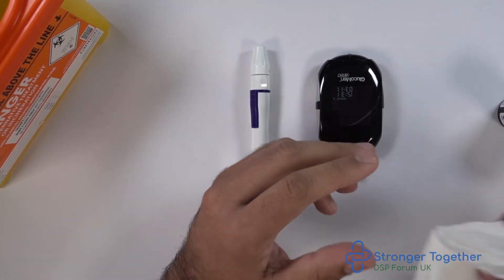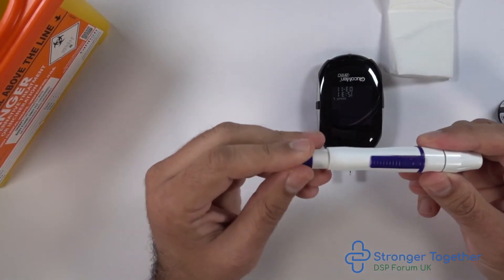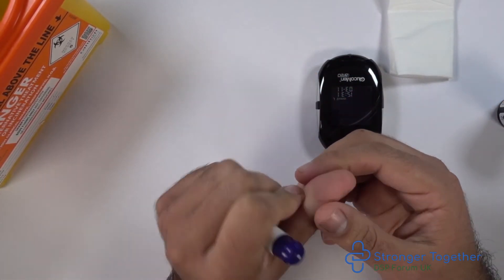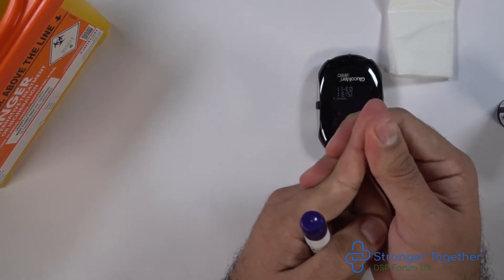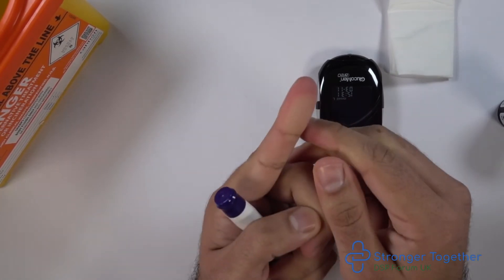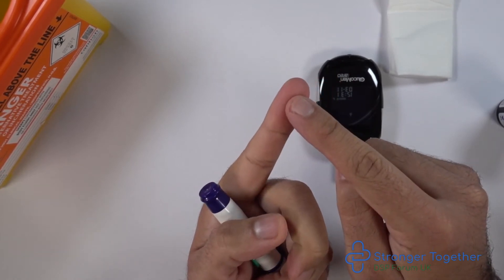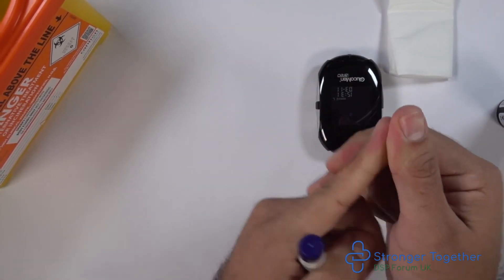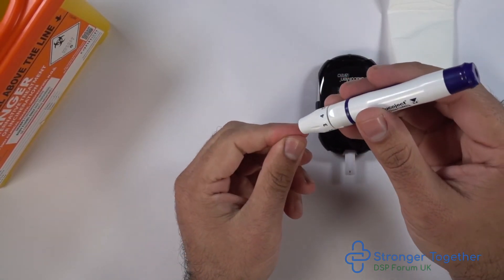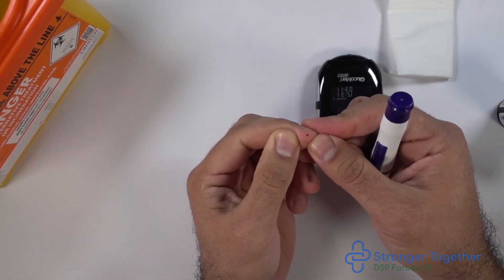Here we have a tissue ready. When getting ready to lance our finger, make sure you have loaded your device beforehand. Remember we will have washed our hands prior to testing. We can choose any of our fingers for the procedure. Remember to rub your fingers as shown here. Remember to lance your finger on the outside portions of the finger and not on the pad. Make sure our lancing device is loaded and ready. Place the lancing device against the finger and then press the green button.